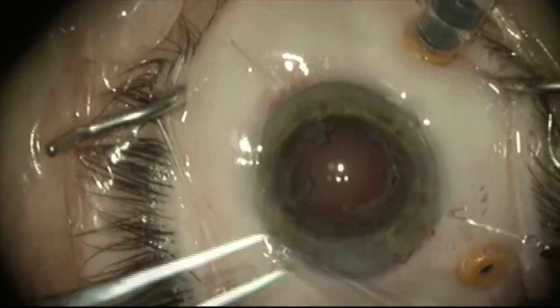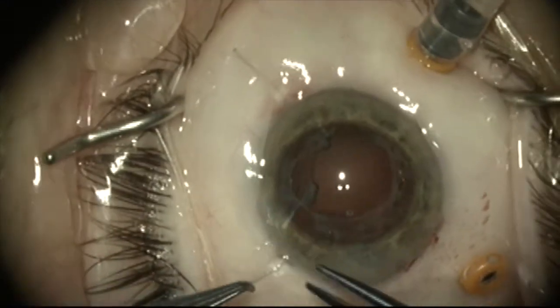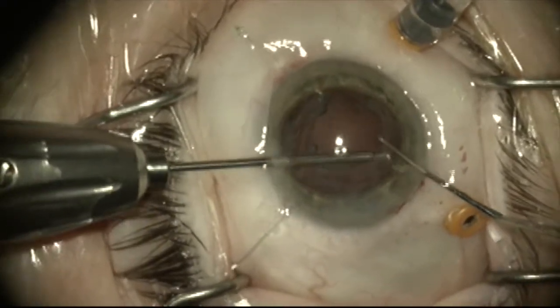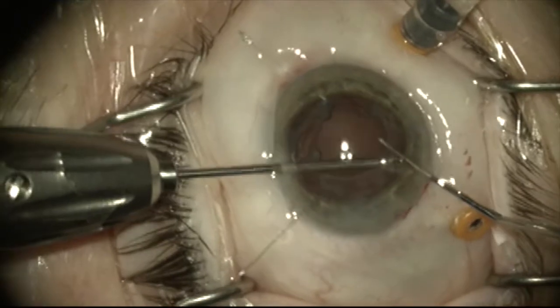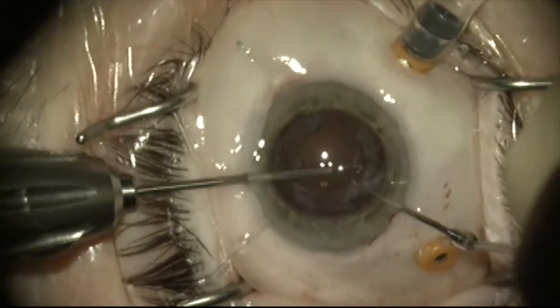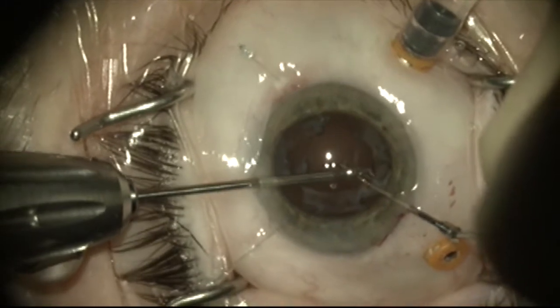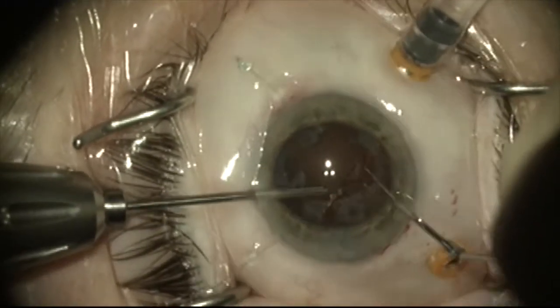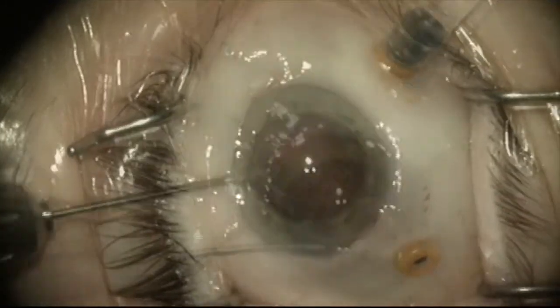As I'm dissecting some of the posterior capsule fibrosis, you can see that the radial tear extends to include the fibrotic edge of the phimosis. Now there's a complete radial tear and it precludes the option of optic capture, which is what I was hoping to do in this case.